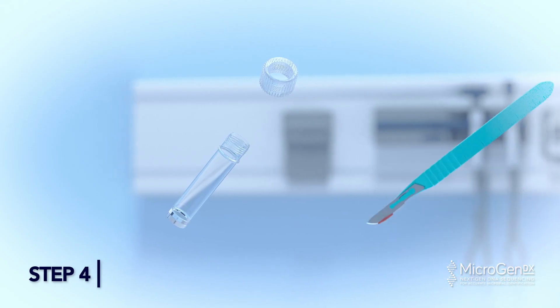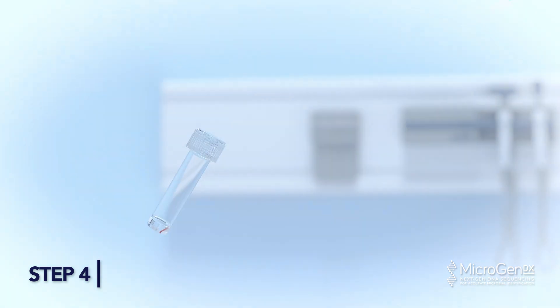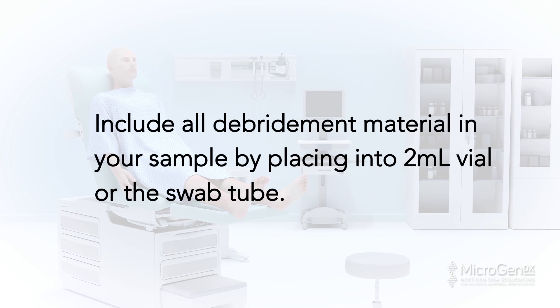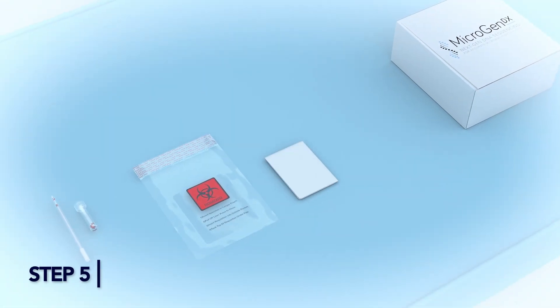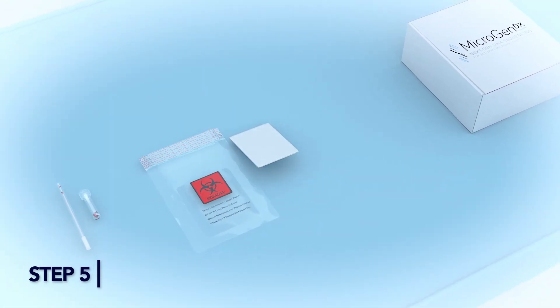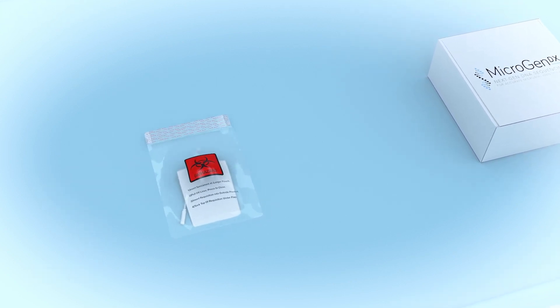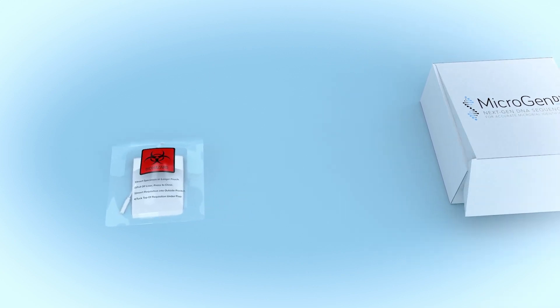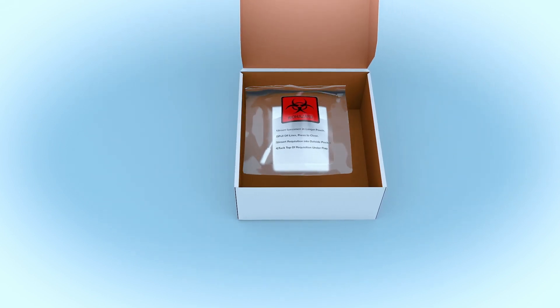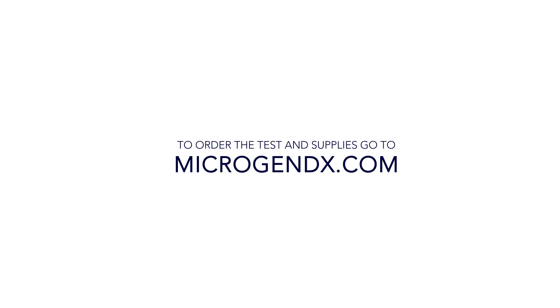Step 4: Transfer sample from tools into the 2-milliliter specimen vial, making sure hands don't make contact with the sample or rim of the vial. Include all debridement material in your sample by placing it into the 2-milliliter vial or the swab tube. Step 5: Place your completed MicrogenDX lab requisition form in the front pocket of the bio bag. Add swab specimen tube or 2-milliliter vial into the larger pocket. Peel off the adhesive strip and press to seal the bag. Place the sealed bag into the MicrogenDX box and ship out according to your facility protocol.